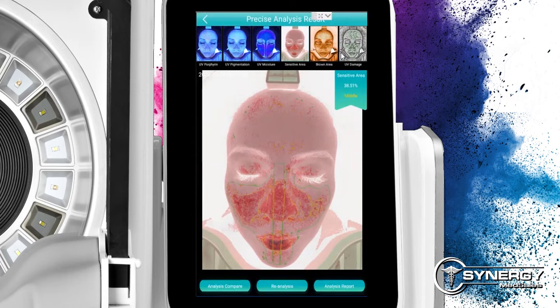Scan them, see if their skin has become acclimated to that product and you're safe to do treatment, or if you have to send them home, have them be off of it for 7 days.